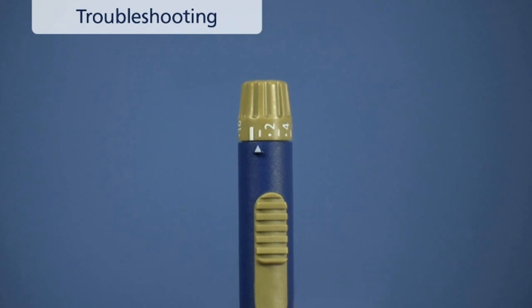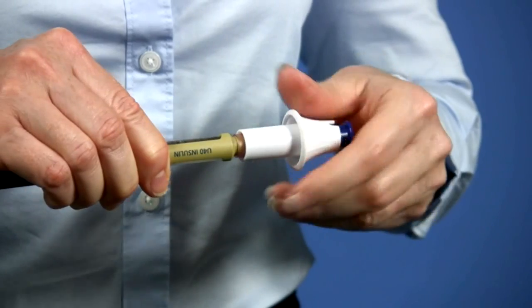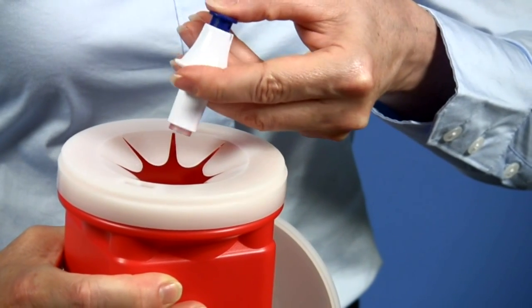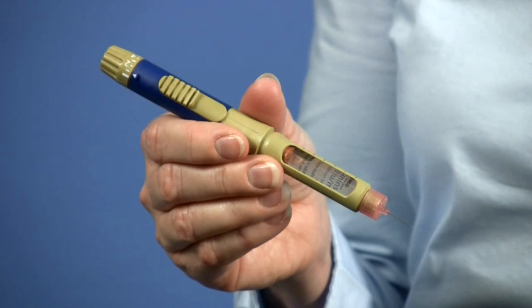If the dose selector does not return to the starting line and no insulin is expelled after priming, then you need to check the needle and the cartridge. The needle that you are using may be blocked. Safely remove and dispose of the needle currently attached to VetPen with the needle remover before replacing it with a new one. The second possibility is that the cartridge plunger may be stuck.